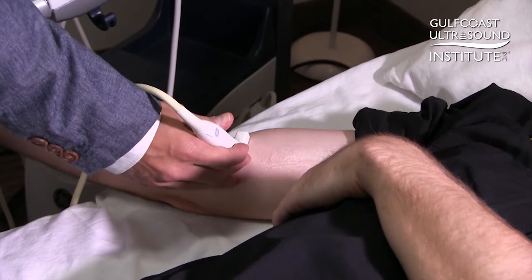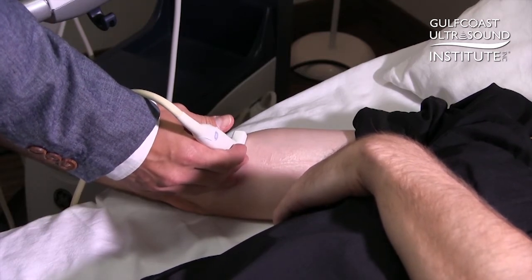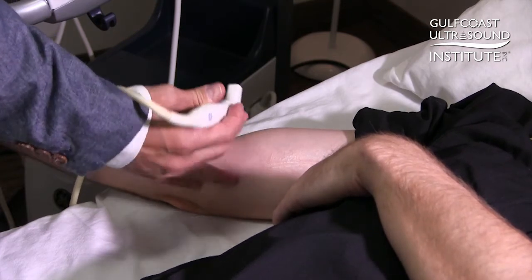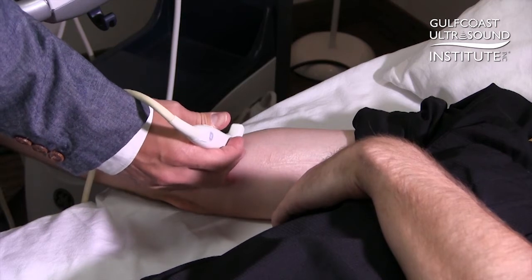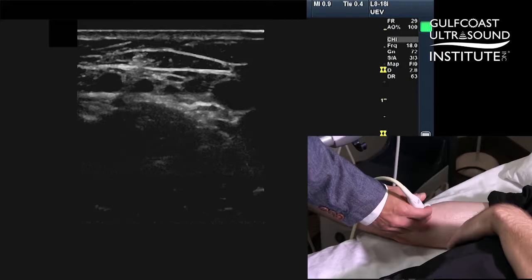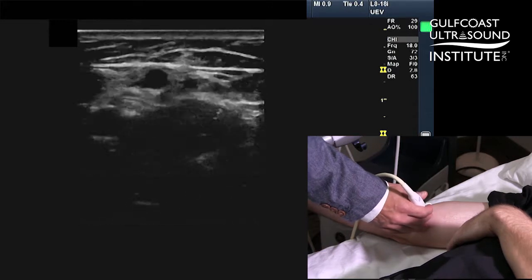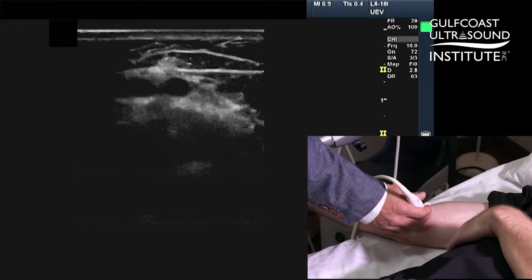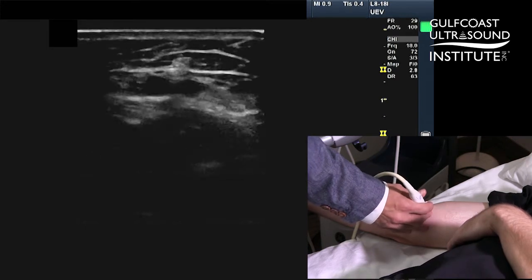A couple of key things to keep in mind when you are using ultrasound to find a peripheral vein for vascular access: one, make sure that you're holding your hand stabilized on the patient so that you can apply just the right amount of pressure. You want to be stabilized in your hand and then control with your remaining fingers — first three fingers here — the amount of pressure you're applying.